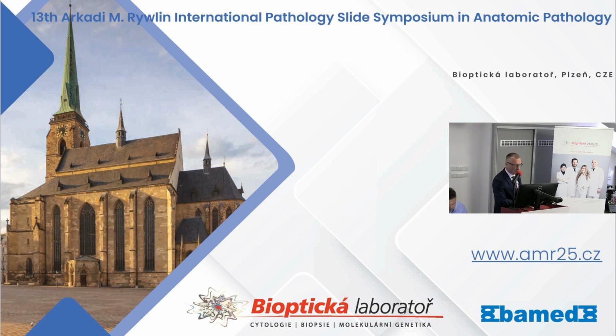Everything we saw, like small cell carcinoma, urothelial carcinoma, even lymphoma, and so on, was marked as carcinoma, but the system, with high confidence, marked it as acinar carcinoma. And it's okay. So again, you will get it marked as carcinoma. It will be sure it's malignant, but you have to look at it, and you have to make sure it's really acinar carcinoma, it's not something special.